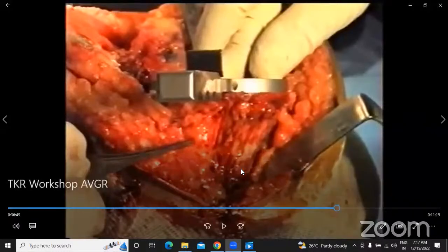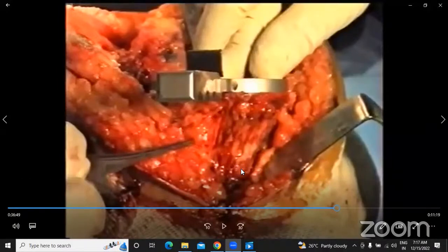Suppose considering the femoral component, usually the tibial component matches with the femoral one size up to two sizes down. Suppose compared to the femoral component, after taking two sizes down also, I have a little bit of overhang. Anterior overhang is not acceptable, as I know. Is the overhang acceptable on the posterior side?